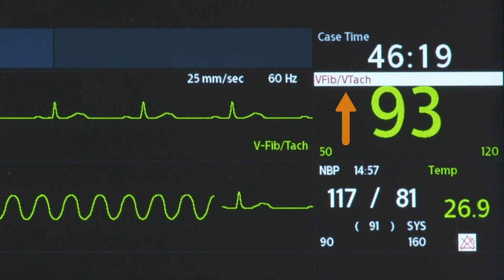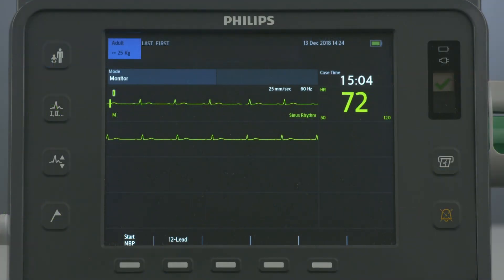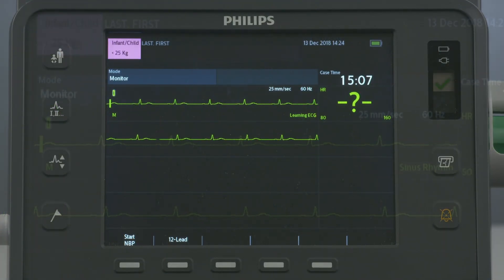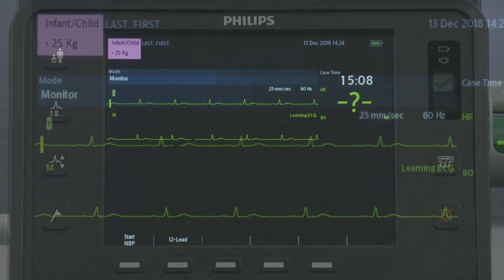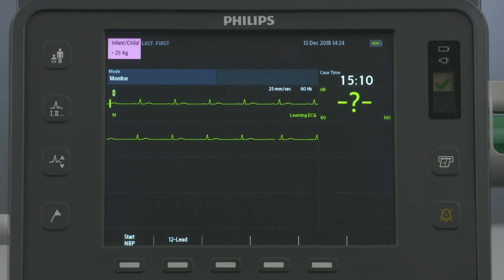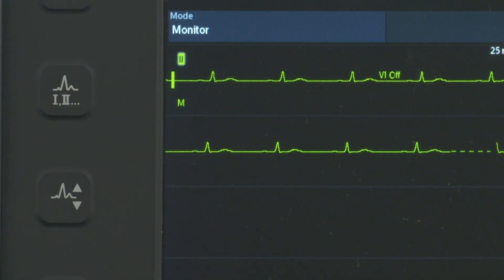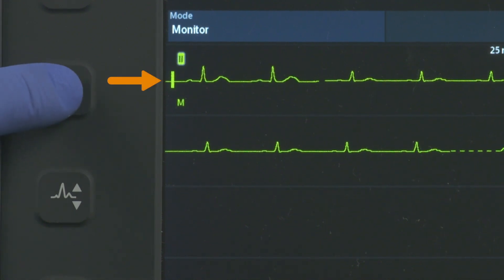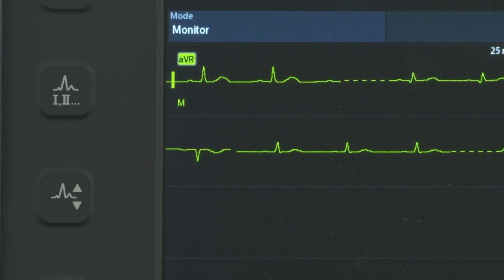Physiological alarm messages appear next to the patient-related parameter they are associated with. The patient category button switches between adult and child patient categories, changes alarm limits to the new patient category, and adjusts the energy setting for defibrillation in AED mode. The Lead Select button changes the ECG lead in Wave Sector 1, cycling through the available ECG waves and changing the displayed wave and its label.